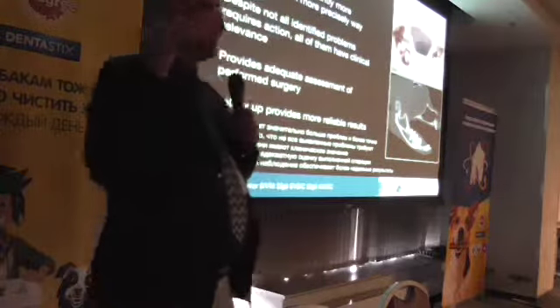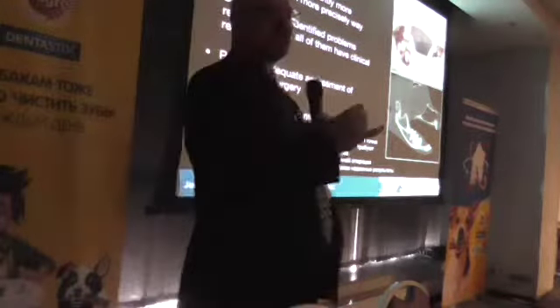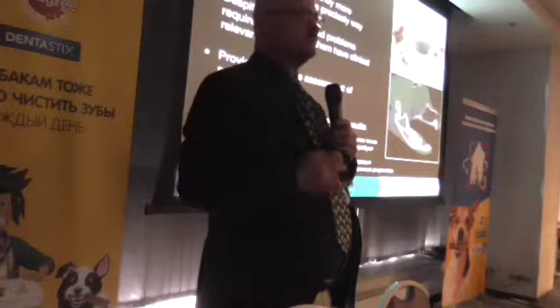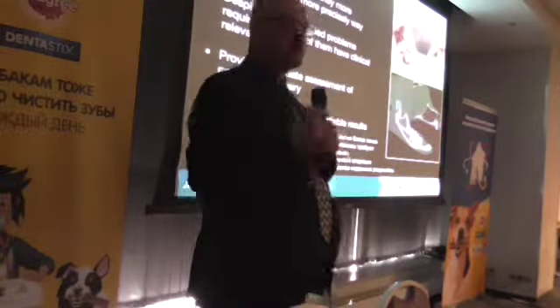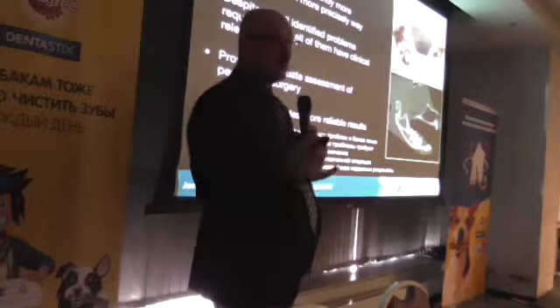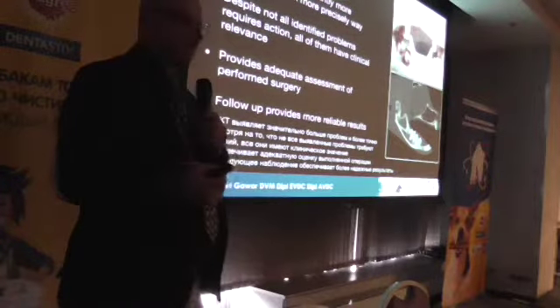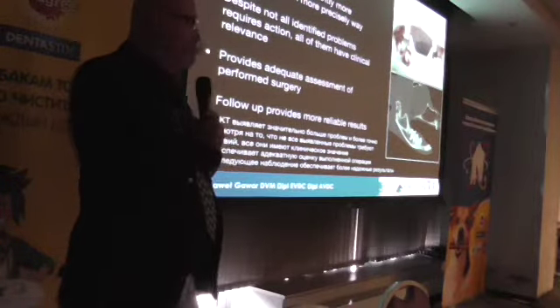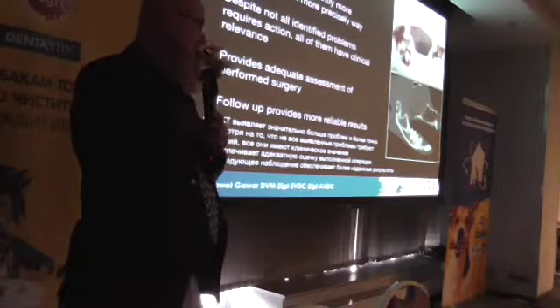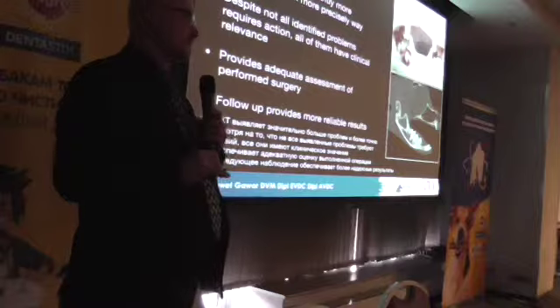But if you have a head injury, we don't have a lot of time to precisely do a series of two-dimensional X-rays, and still the quality of them is not sufficient to diagnose the problem. We should be quick because head trauma requires minimizing the anesthesia time.